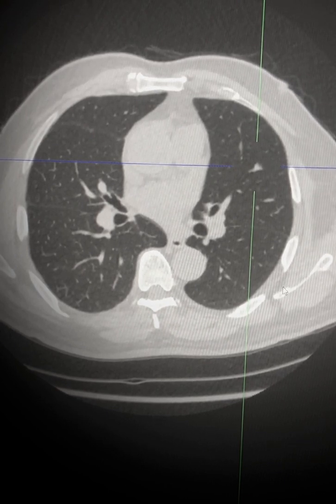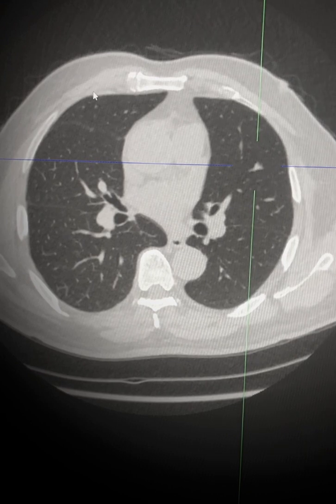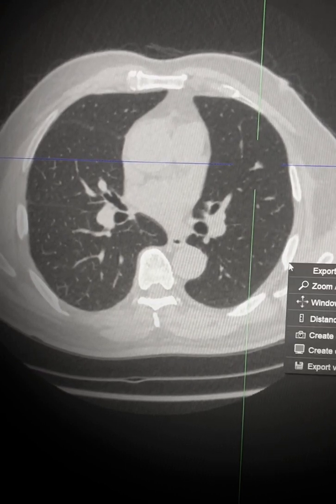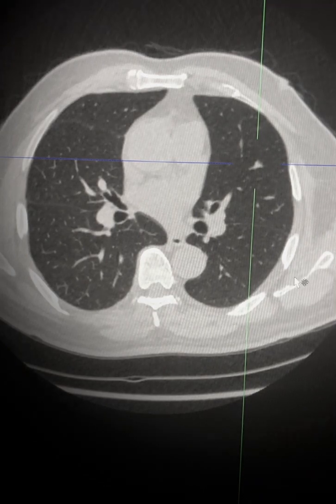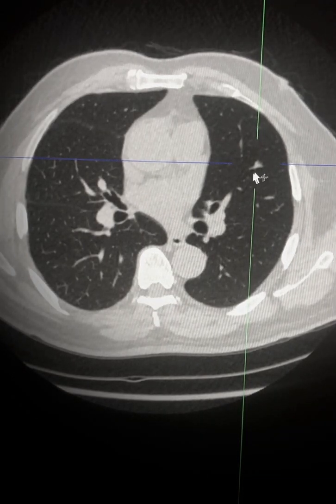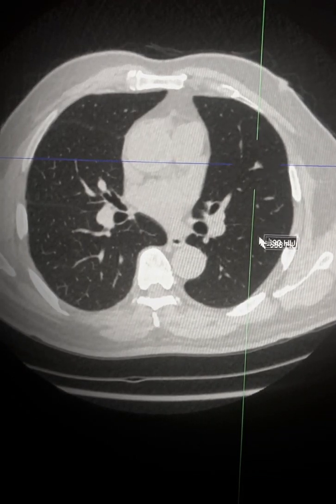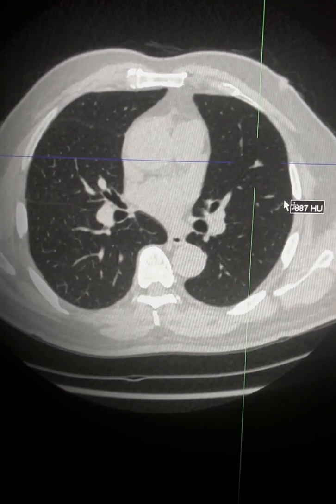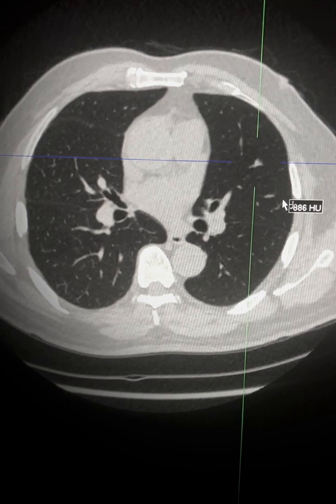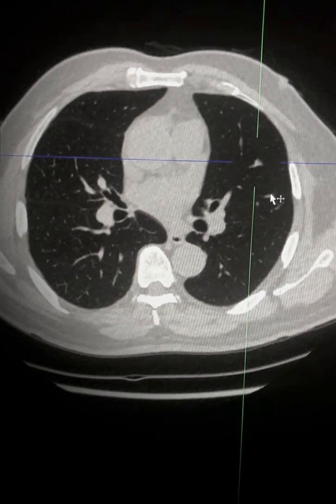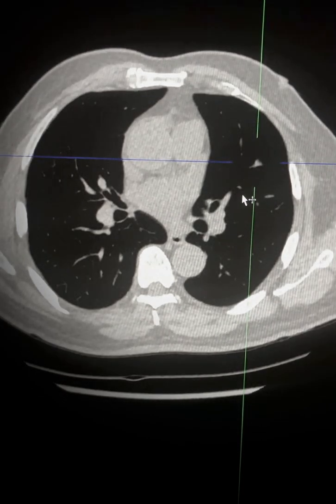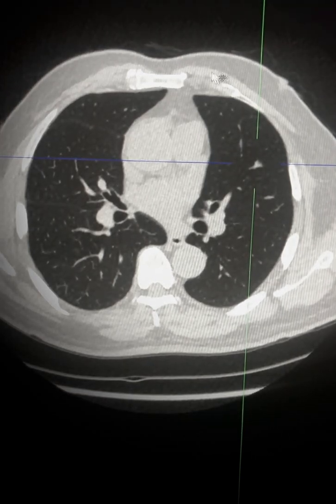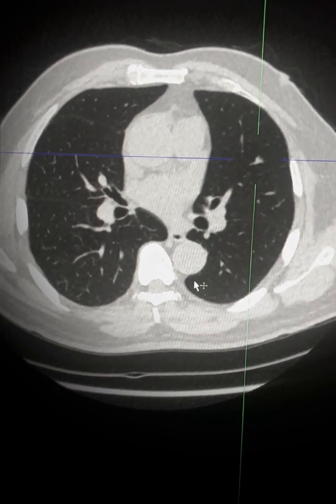The first tool is to maximize the contrast differences between various structures. If you have a choice, it is better to have a post-contrast scan where you can delineate a vessel from a nodule and delineate other fatty and soft tissue structures. If you do not have a post-contrast scan, you can use your window settings so the tissue plane can be slightly more conspicuous depending on your window width and level.